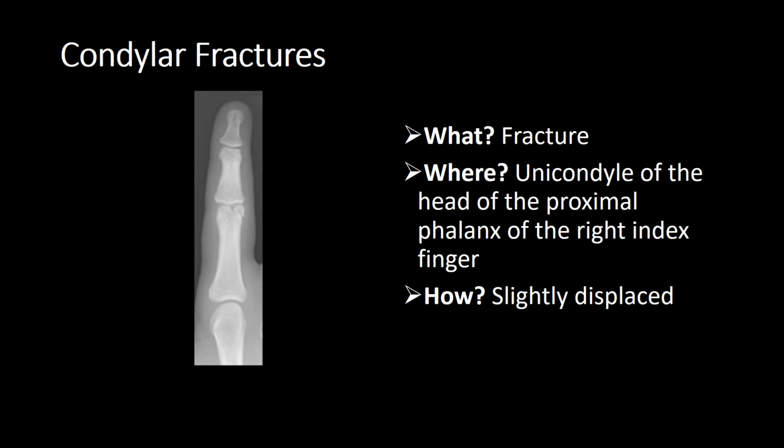What is it? It's a unicondylar fracture of the head of the proximal phalanx of the right index finger. How? It's slightly displaced.